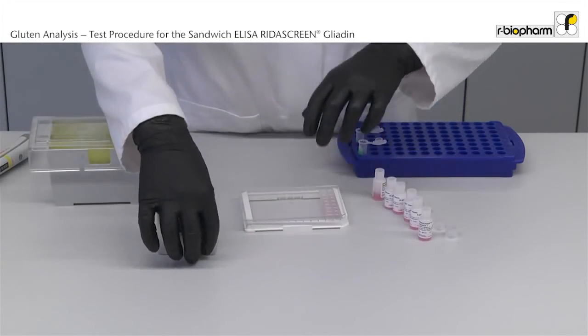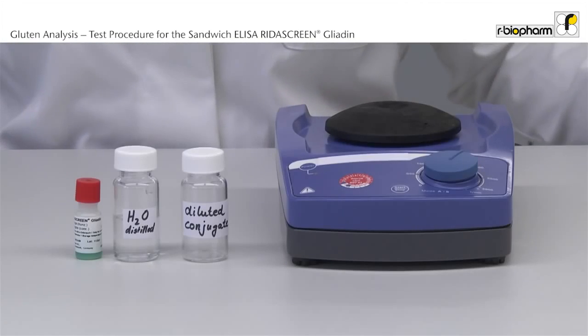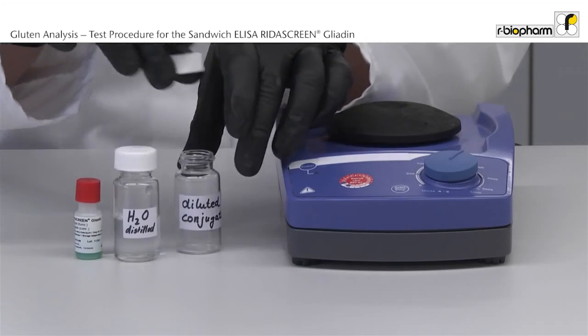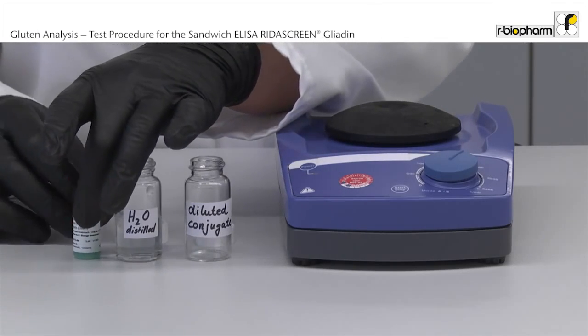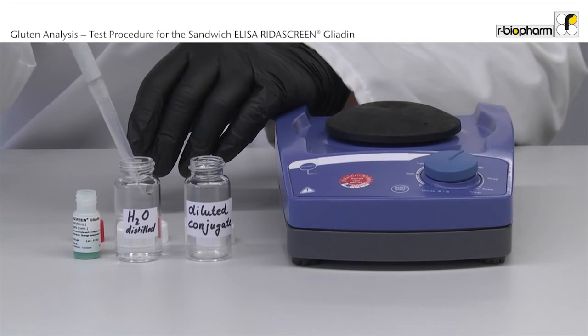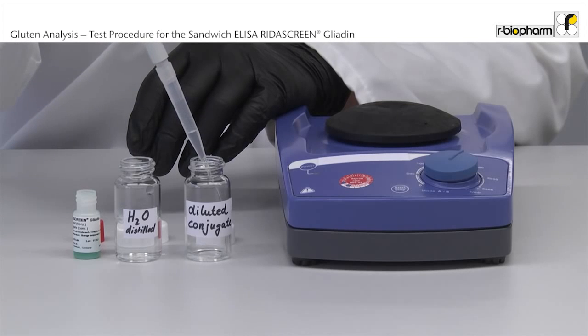Incubate for 30 minutes at room temperature. During the incubation time the conjugate is diluted 1 to 11. Add 200 microliter concentrate to 2 milliliter distilled water and mix gently manually.